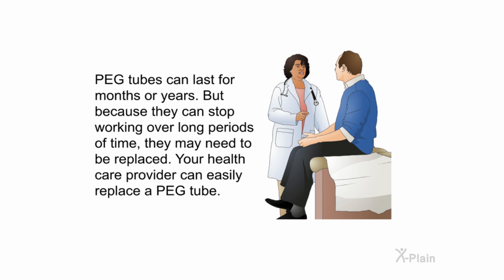PEG tubes can last for months or years, but because they can stop working over long periods of time, they may need to be replaced. Your healthcare provider can easily replace a PEG tube.